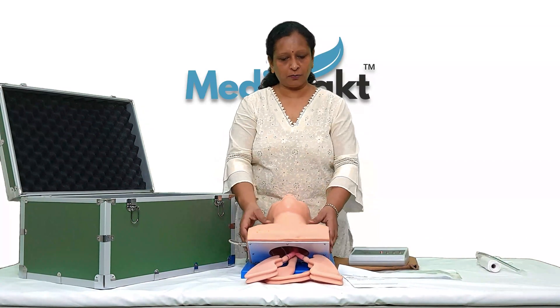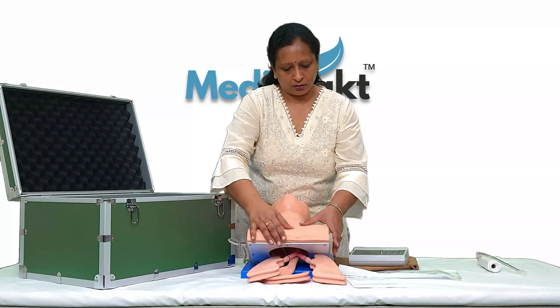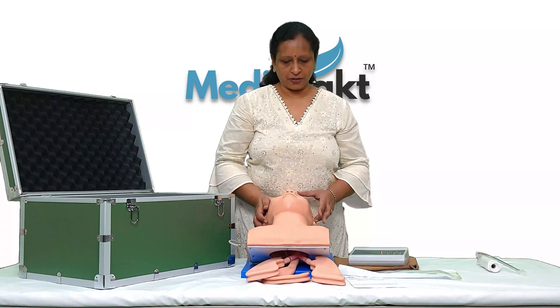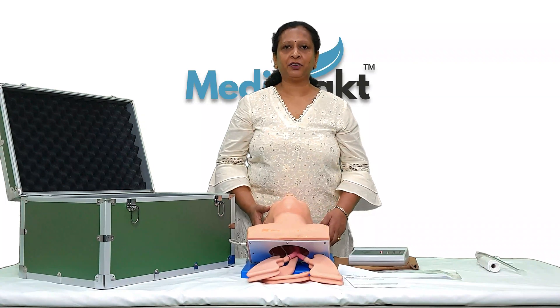This mannequin is not made of fiber — it's made of unbreakable PVC plastic. All soft parts are imported, made of soft PVC plastic. Thank you, that's all about this electronic trachea intubation mannequin.